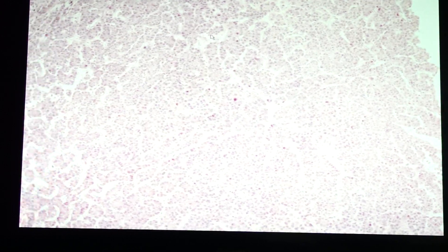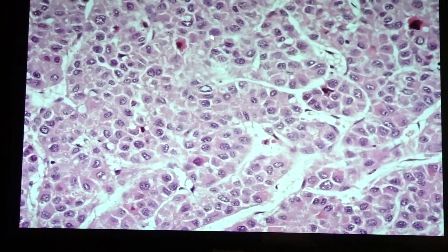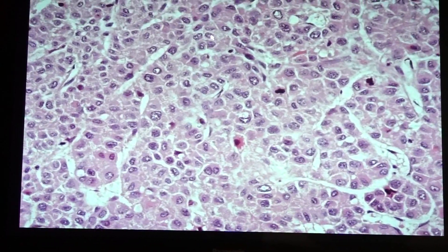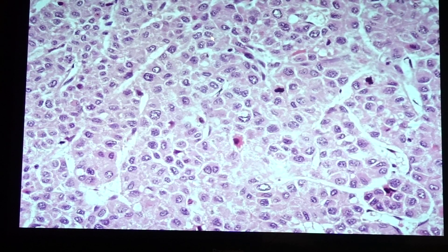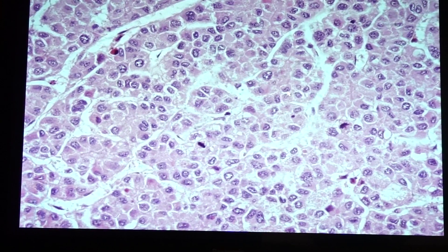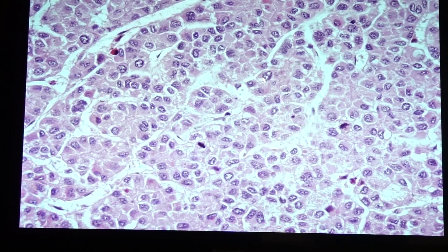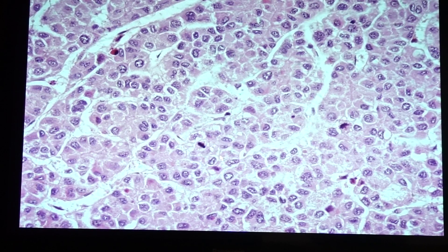Our last slide is also hepatocellular carcinoma. This one appears more similar to cirrhosis. One thing to look for is variation in the size of the nuclei and the presence of mitotic figures. The thickness may not be as evident in some areas — it can be more than three hepatocytes per liver plate but is not always obvious.